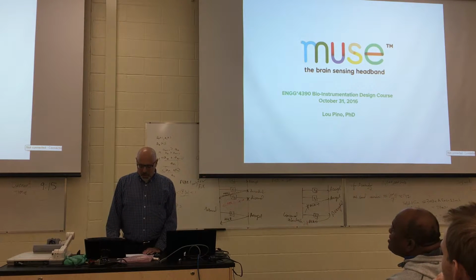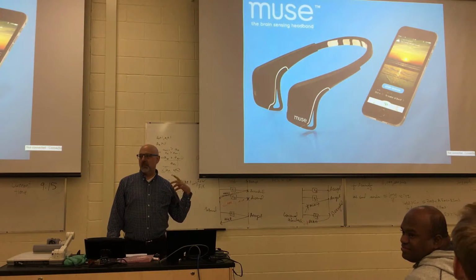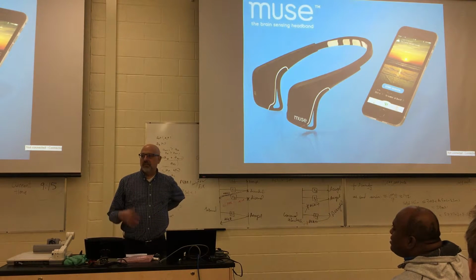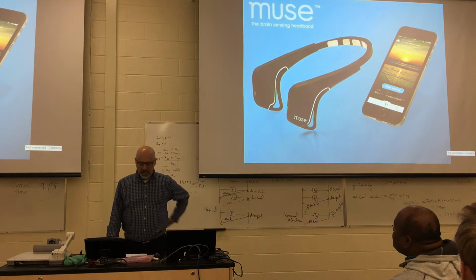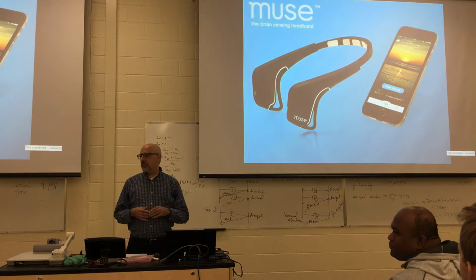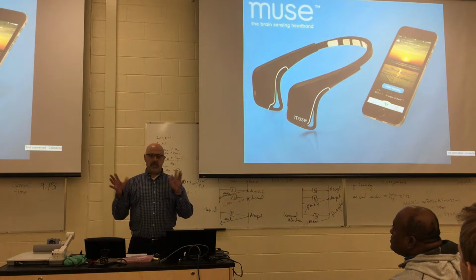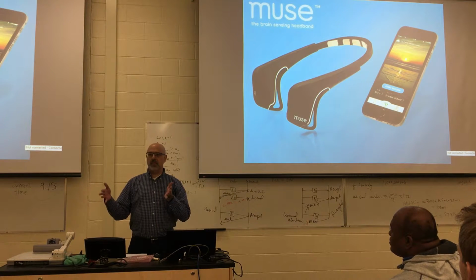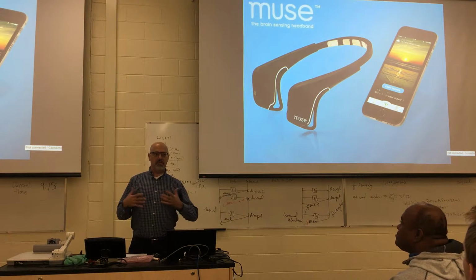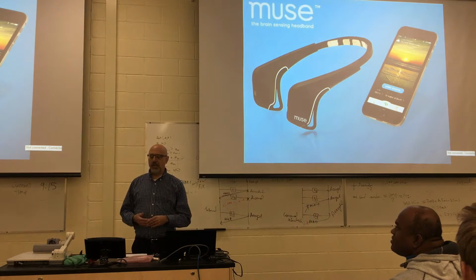So what I'm going to talk to you about today is, I'm going to give a background on Muse and its consumer application. I brought one here. Then a little bit of background on electrophysiology and EEG to tell you more about the instrument. And then the main topic is to walk you through the development process of a classifier that we built for the Muse. The classifier predicts whether a segment, 1 second of the EEG signal that we're picking up from the sensors, is actually a brain signal or some contamination, such as eye movement or muscle tension and that sort of thing. That's the main topic, but I want to give you a little bit of background before I get into the development problem that I'm going to go through.